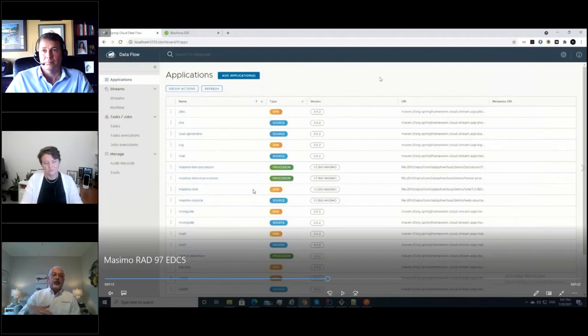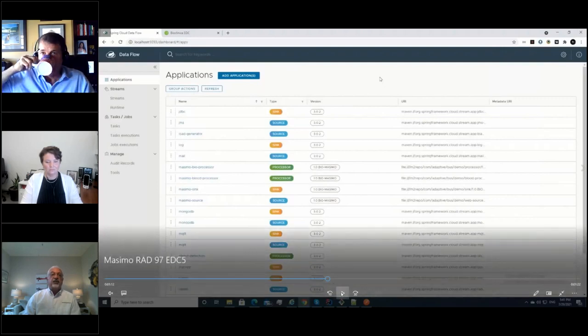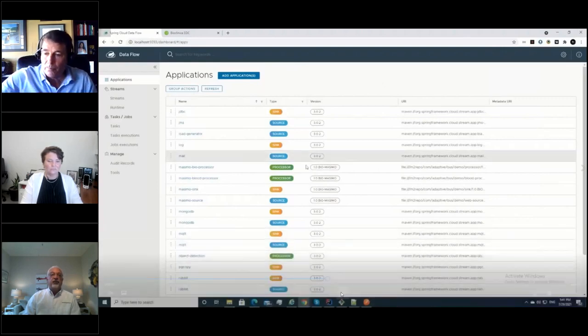So why the layers? Well, the reason for the layers is you need to insulate the actual getting the data, reading it in, from the actual data transformation tool, from the actual pushing it to the target system. It economizes validation and makes everything faster for repeatability for subsequent setups.